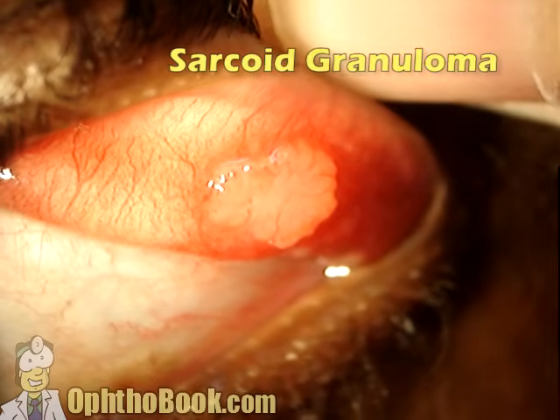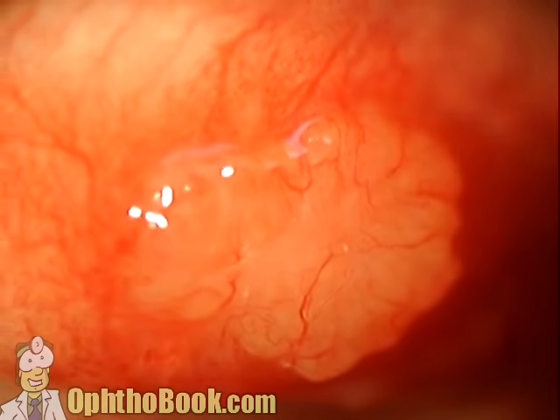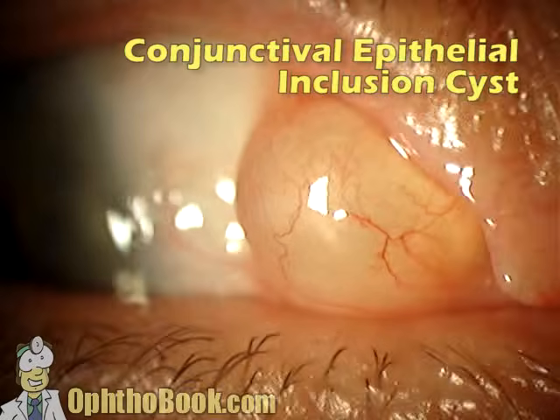We'll look at the upper lid. Here's another lesion. This is some type of granuloma. We biopsied, ended up being sarcoidosis, and we diagnosed that disease process. Looking at the conjunctiva and sclera, the conjunctiva here has a very large cystic structure.